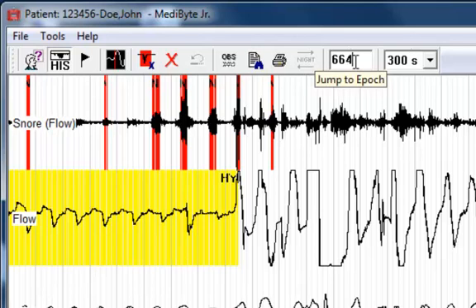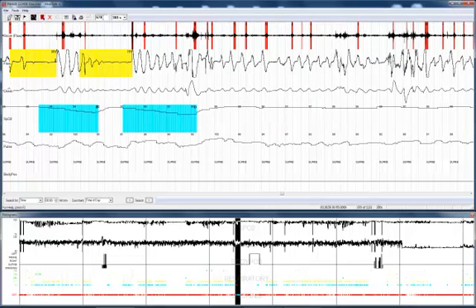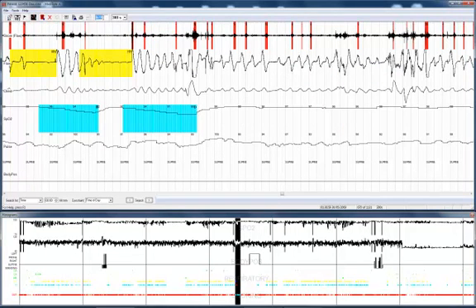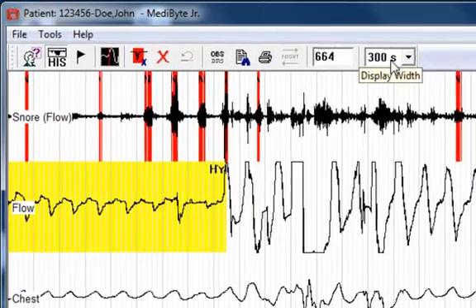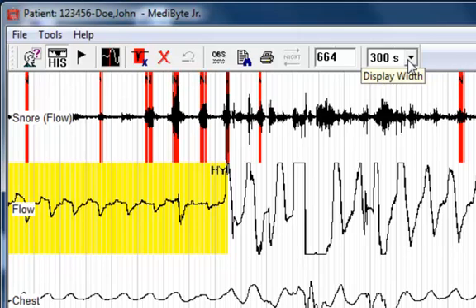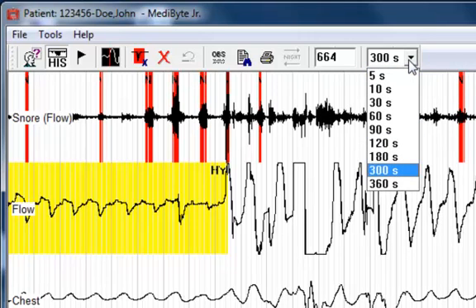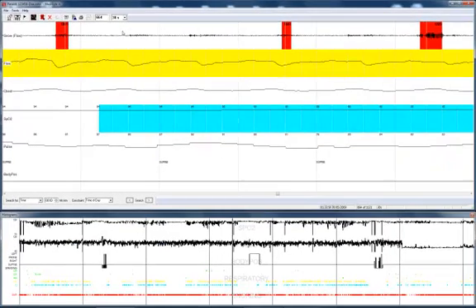The jump to epoch allows you to manually enter a page and jump to that section. The display width is a drop-down field which allows you to select the display width you wish to look at. For example, if I wish to go to a 30-second display width, I can go up to as long as 6 minutes or as short as 5 seconds.